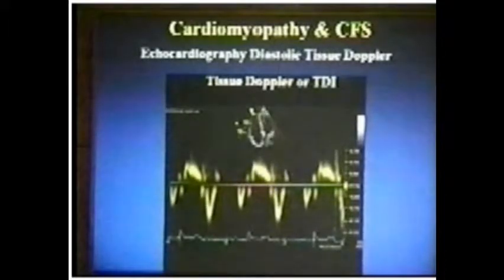And that's not always expressed in this particular value. So there are people, for example, who may have pretty good-looking numbers that don't look too bad, but they nevertheless have diastolic dysfunction, the most sensitive measure of which is the IVRT, isovolumetric relaxation time. The timing between aortic closure and mitral opening is the time interval by which all the energy is virtually expended. It's measured in milliseconds. And if you have low energy, the IVRT prolongs because you take more time, if you have less energy, to dump the calcium out of the cell. The IVRT, therefore, may be the best number to measure energy in the cell.